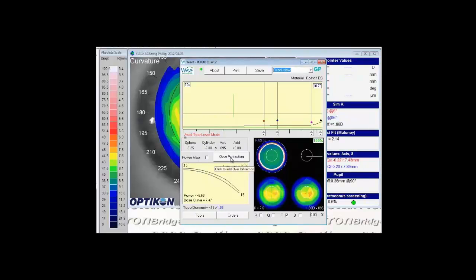Now when I select the over-refraction, you'll notice it's plano. So it's good to note that it's there. The times where that will be of more value is when we have a lot of residual cylinder that's not on the cornea and that you may need to enter beforehand on your initial lens. But if the spectacle RX cylinder and the corneal cylinder are close match, you will not want to use that value to begin with.